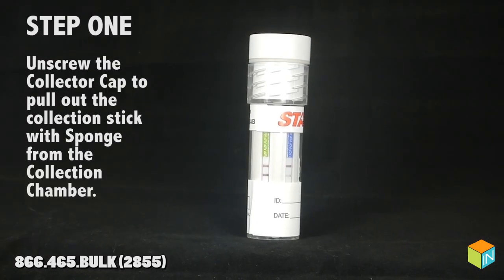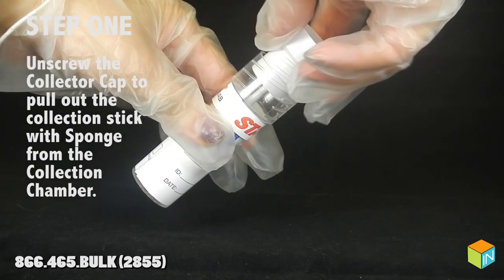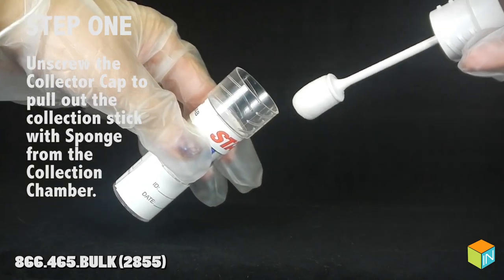Step 1: unscrew the collector cap to pull out the collection stick with sponge from the collection chamber.